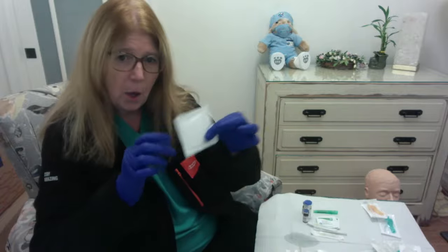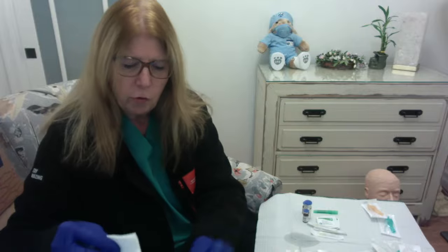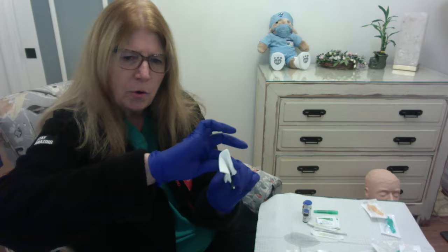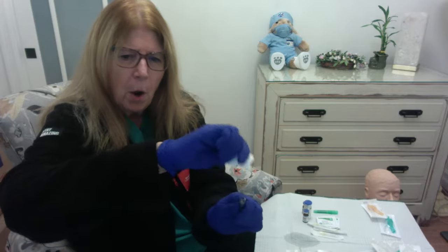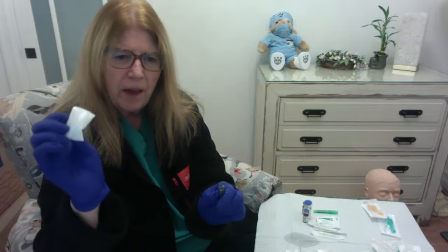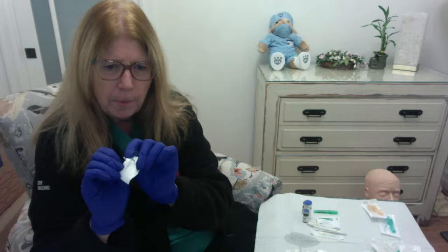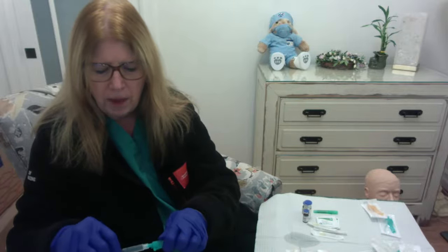I'm going to take a gauze pad. I'm going to wrap that around the top, and again, I'm using my thumb to push forward away from me. And then this ampule top, which is here in my gauze, this ampule top is going to go into the sharps container, and once again, I'm going to draw that medication up out of the ampule.